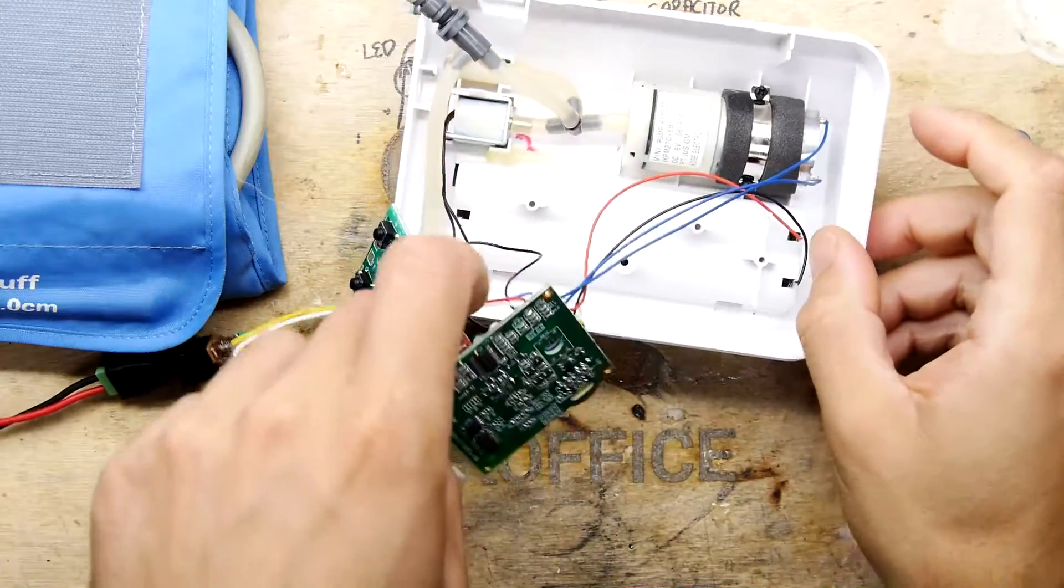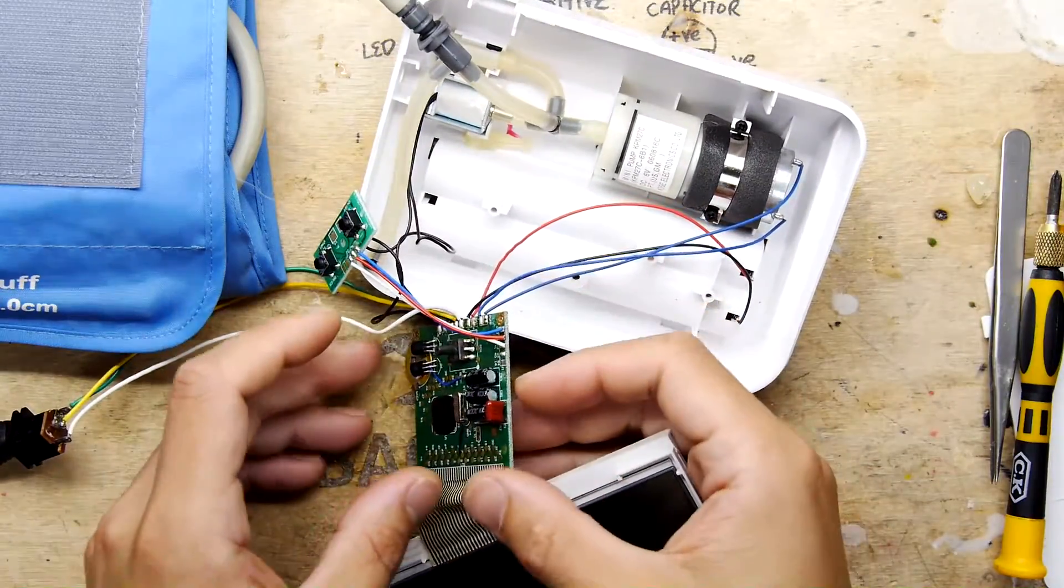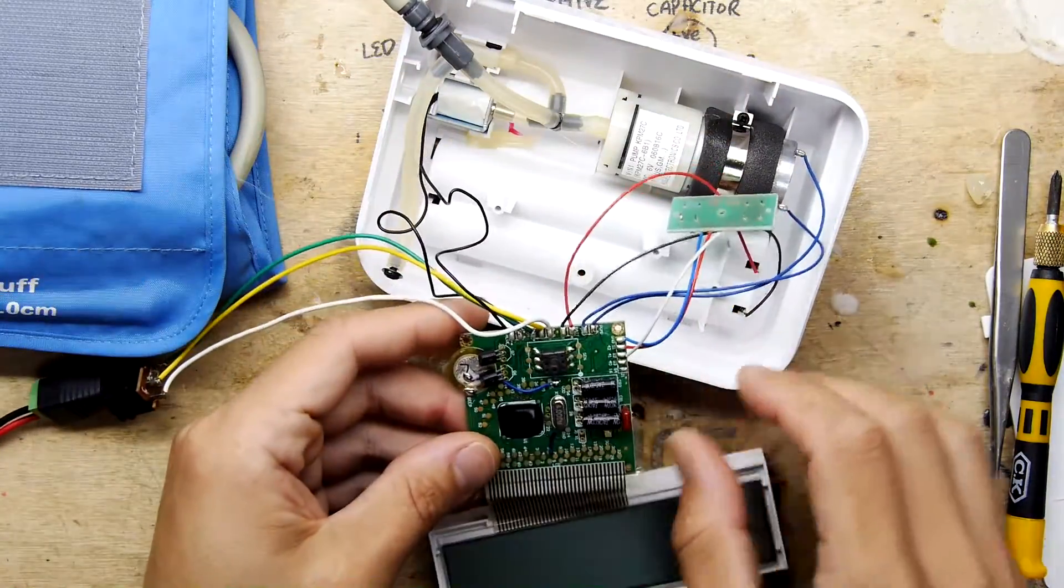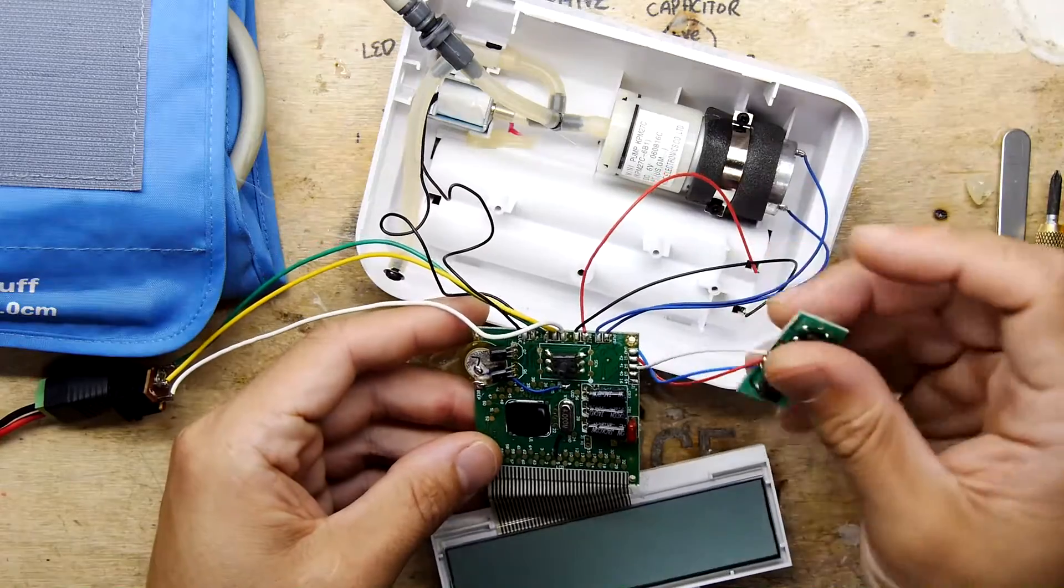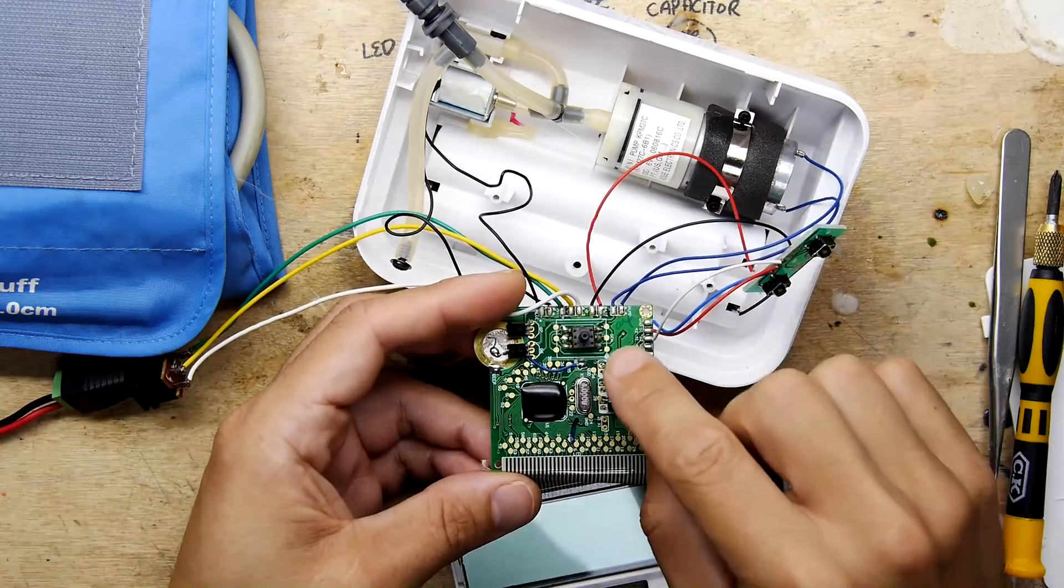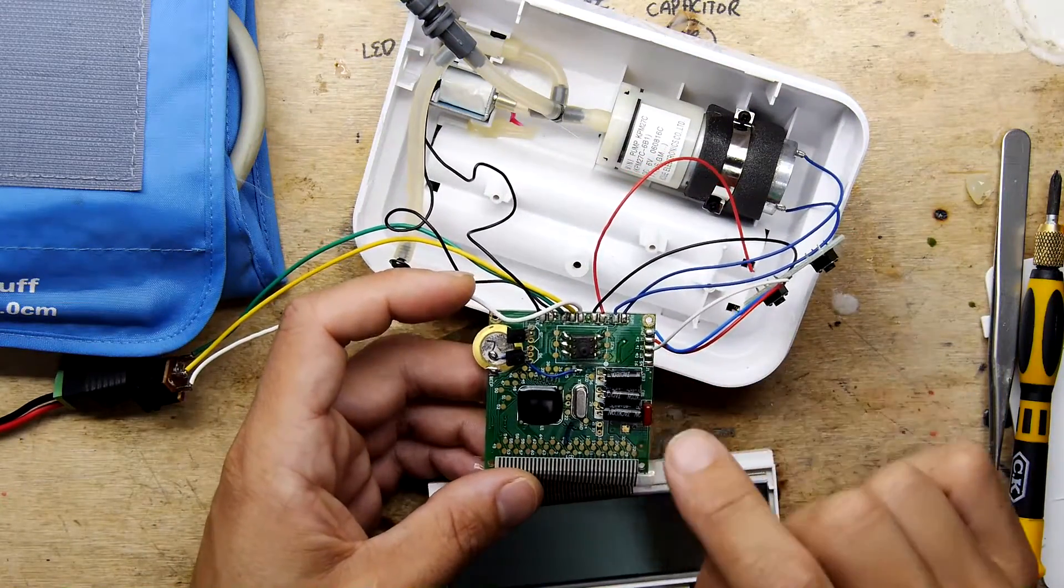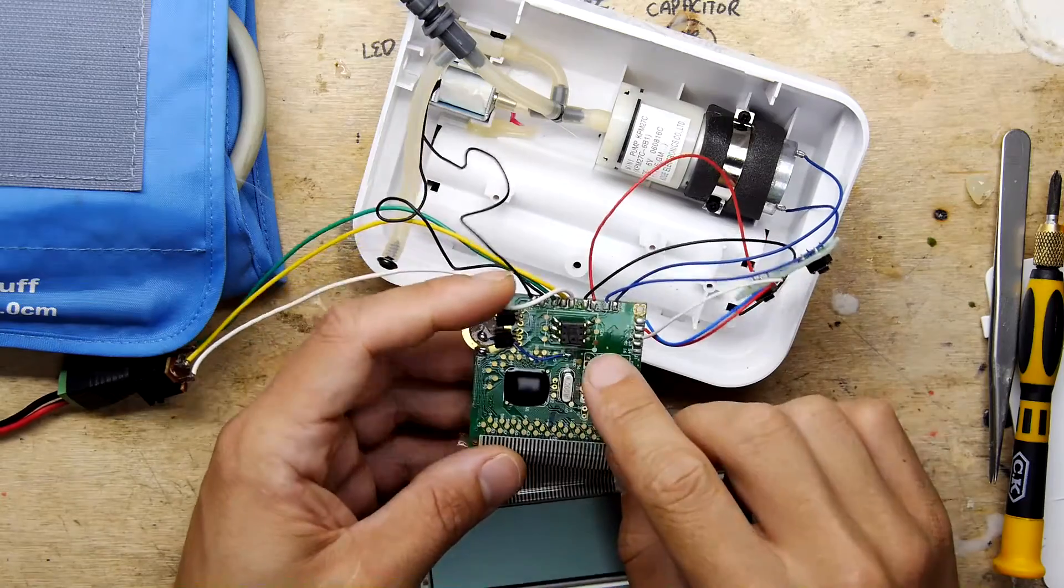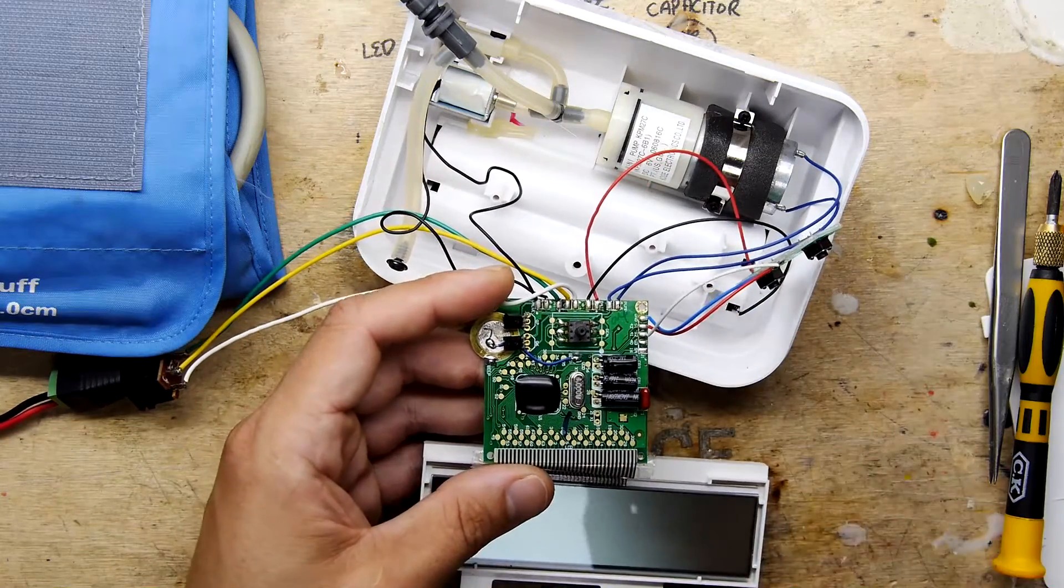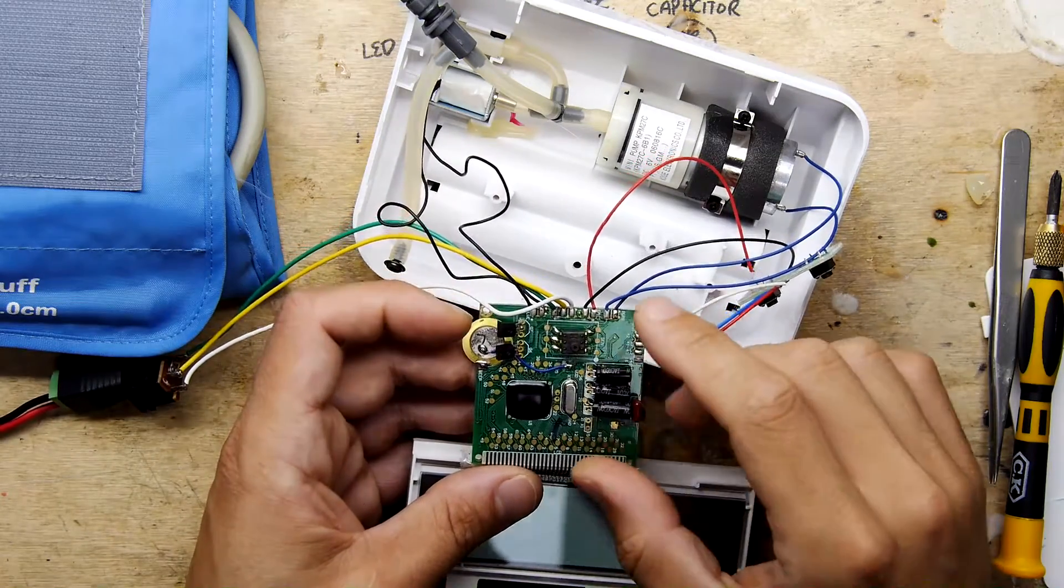So that's absolutely a fun thing to have, isn't it, as a sort of project workbench here, because you've got good stuff here. You've got tact switches. You've got decent looking caps. You've got a pressure sensor, which are expensive, or used to be very expensive to buy to play with.